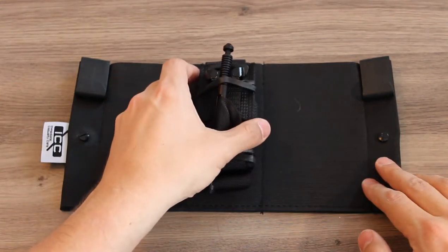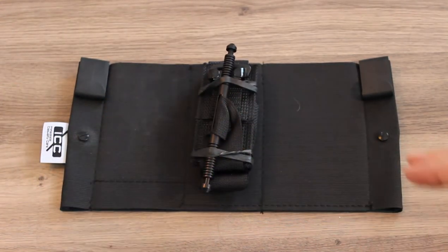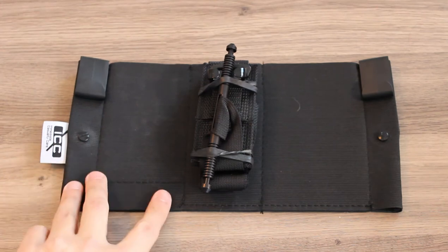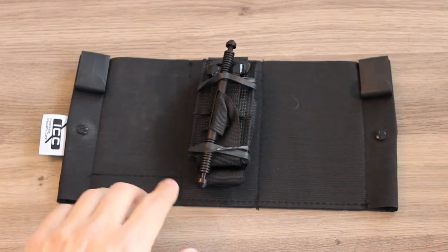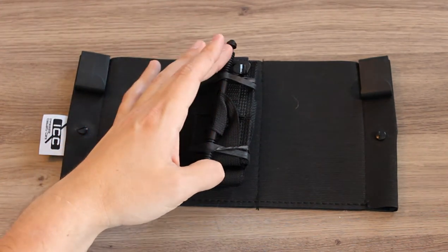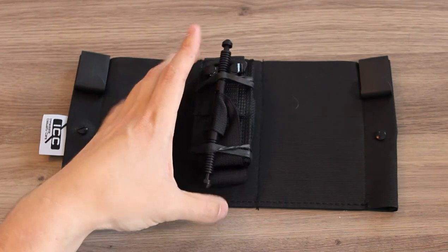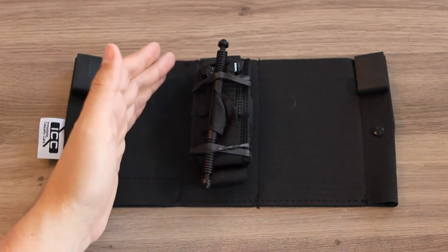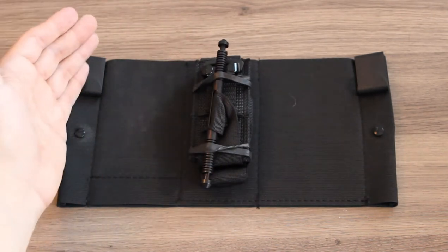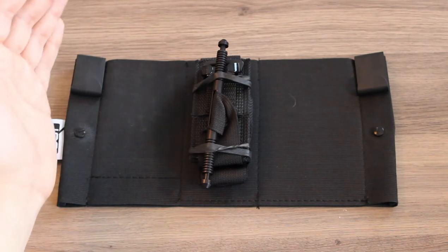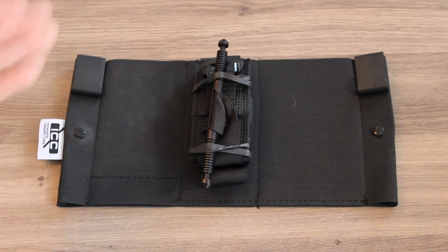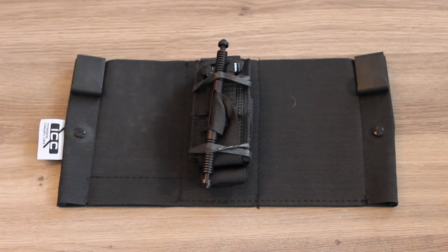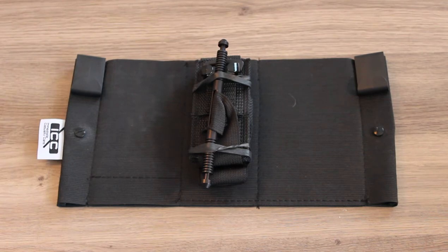In this case we have the Soft-T Gen 4 tourniquet. But keep in mind if you're using a tourniquet like the Soft-T, it has a metal windlass and that is going to make this a metal-containing setup. As such, you will not be able to get through metal detectors or wands without setting off the detector.